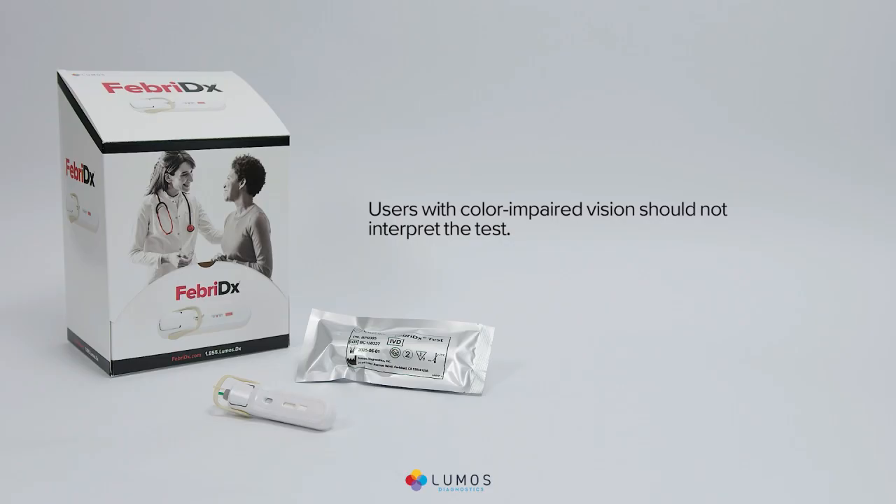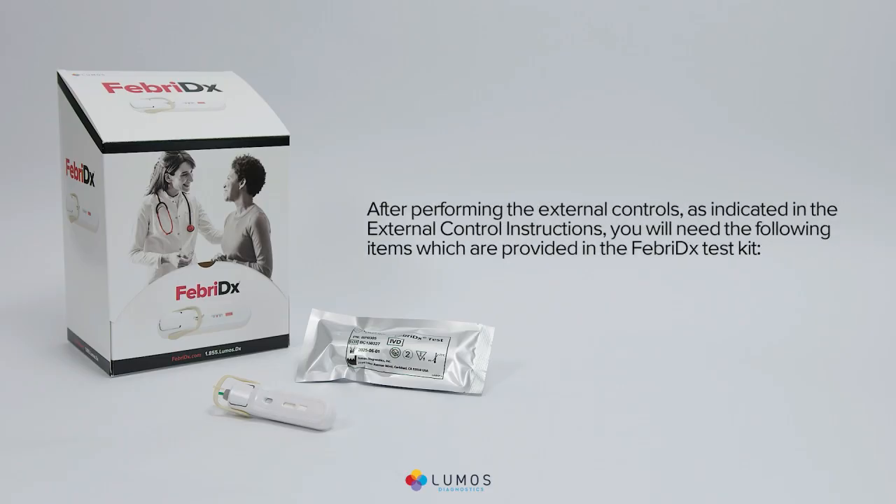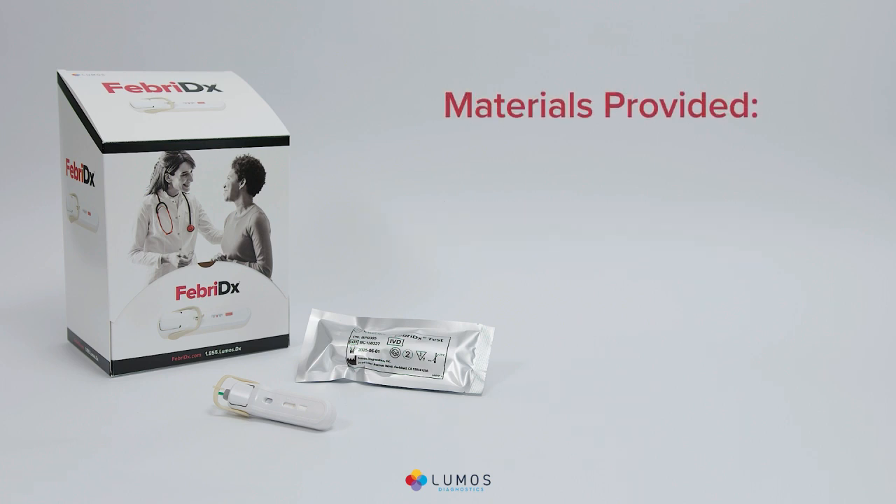Users with color-impaired vision should not interpret the test. After performing the external controls as indicated in the external control instructions, you will need the following items provided in the Febridex test kit: 25 single-use Febridex tests and one package insert.